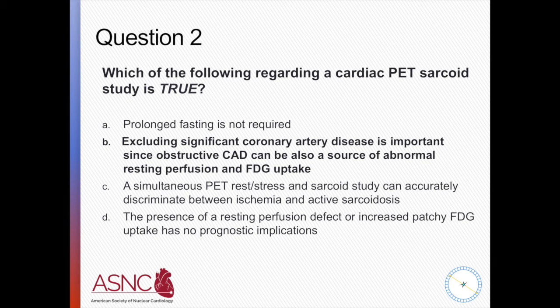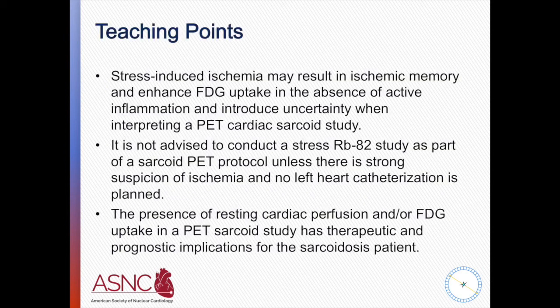Very good, very good. Those are all very important points. And so the teaching points, do you want to go over them? Yeah, let's start with the indication. Any patient with sarcoid involving extracardiac structures who has unexplained palpitations or syncope is highly concerning for cardiac sarcoid, and you should pursue a PET sarcoid study. It's important that, to increase the yield and interpretive accuracy of the testing, you have really good preparation prior to the testing.